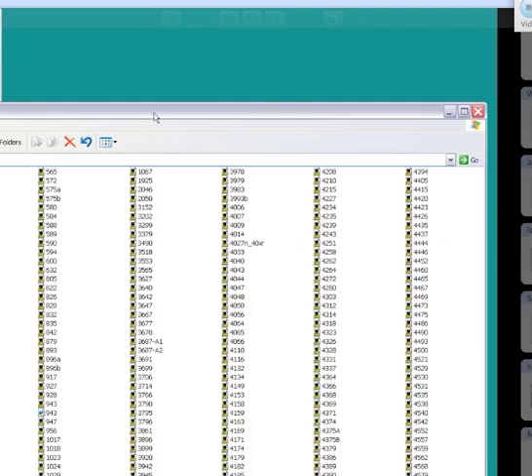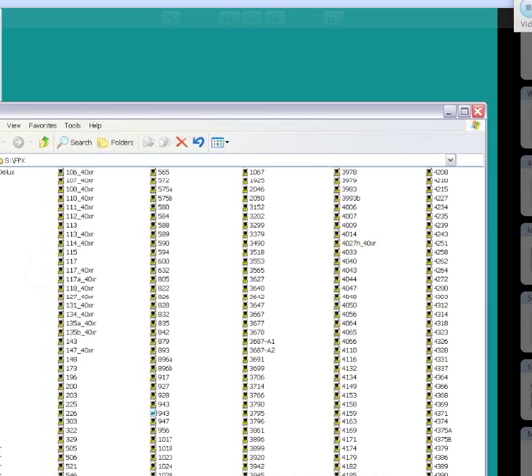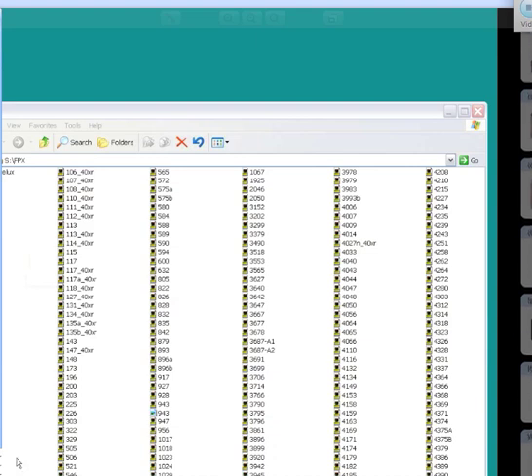Because I started the list under the topic of the gastrointestinal system, the slides were arranged alphabetically. So it's not surprising that the very first case is going to be appendix, because appendix begins with A. I did a little bit of preparation and looked up the classical normal appendix again, and it tells me that is case number 4001.